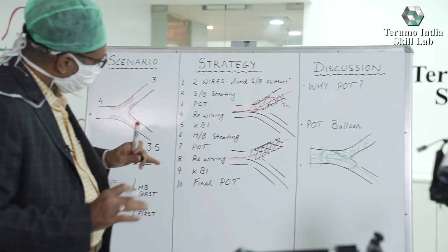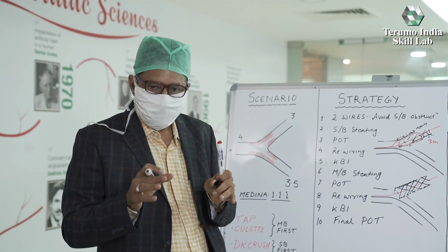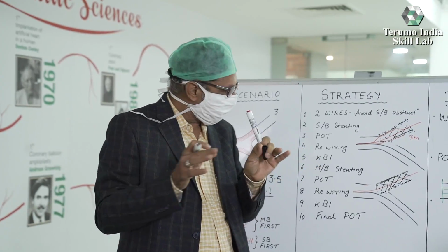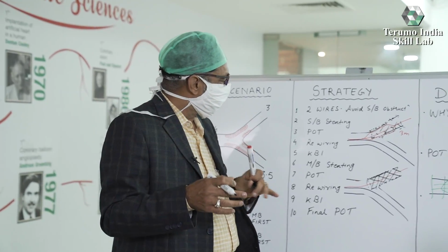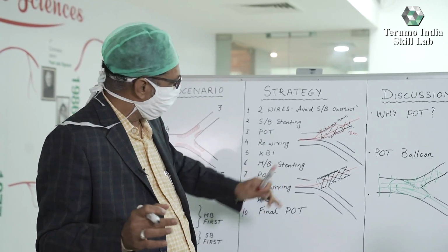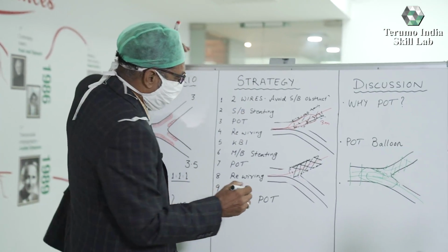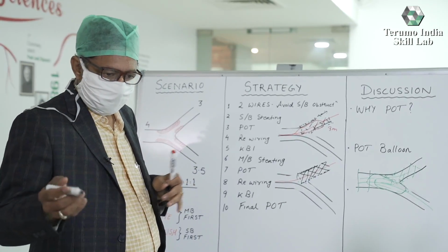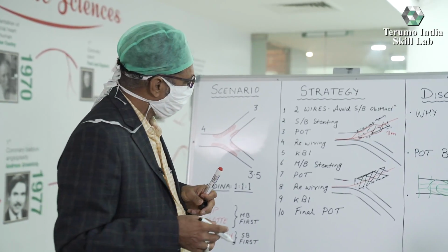The stent gets well apposed at the ostium of the side branch. The ostium is always larger than the side branch as it goes upwards. The ostium is never circular. The ostium is always oval or any other non-circular shape. So here you see the side branch ostium, and the stent proximal to the ostium is a little flared compared to the side branch stent upwards beyond the ostium. So we optimize this deployment with a 3 mm NC balloon, and that is the new step that has been described: proximal side branch optimization.